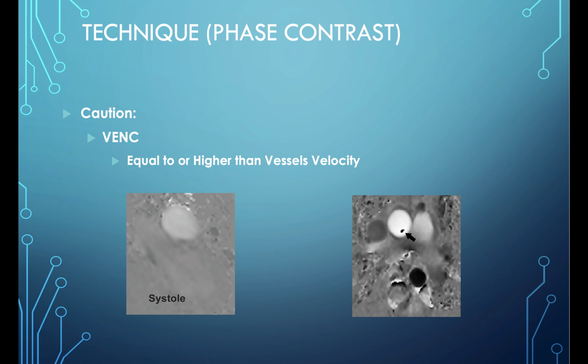It can be done under breath hold or without; as a matter of fact, it doesn't matter here. It's just that usually with breath hold, it's much shorter and reliable. That's why it's preferred to do it with breath hold, because it takes much less time.